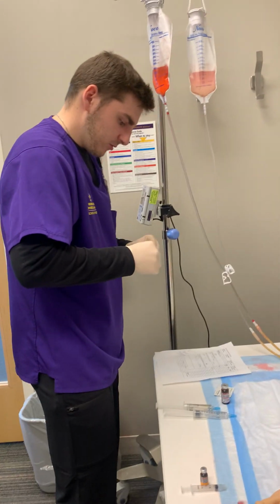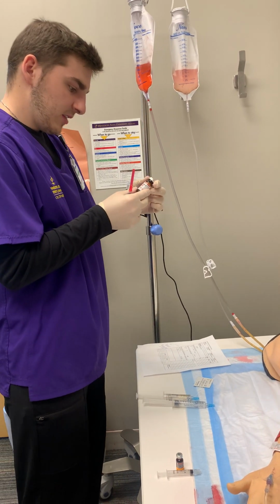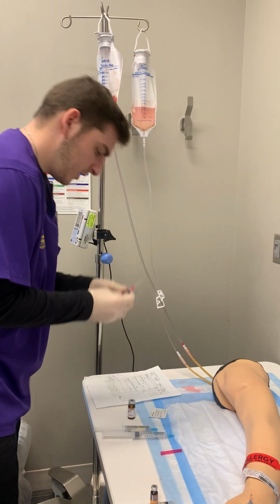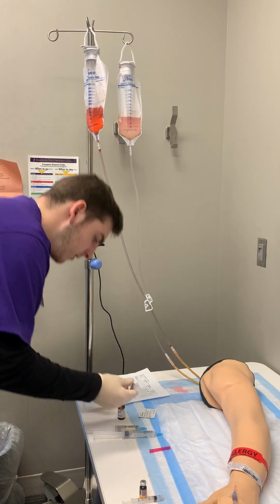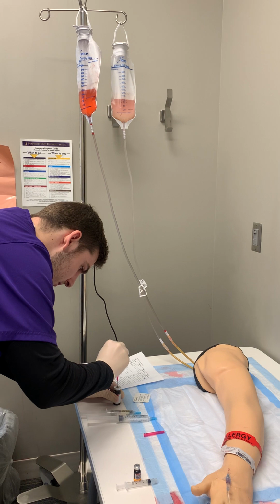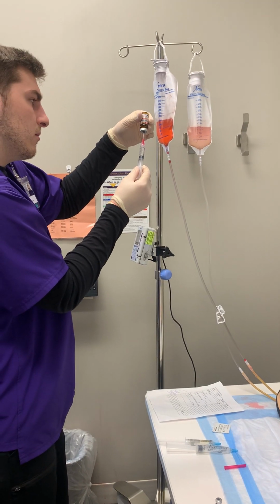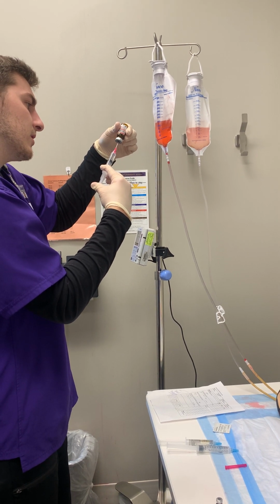And then we're just going to do the same thing for furosemide, and we're looking for 40 milligrams, and this is 10 milligrams per milliliter, so we're going to draw up 4 milliliters. So I'm going to get 4 milliliters of air and then inject that into my vial. This vial is almost empty, so I really got to get it to the bottom.